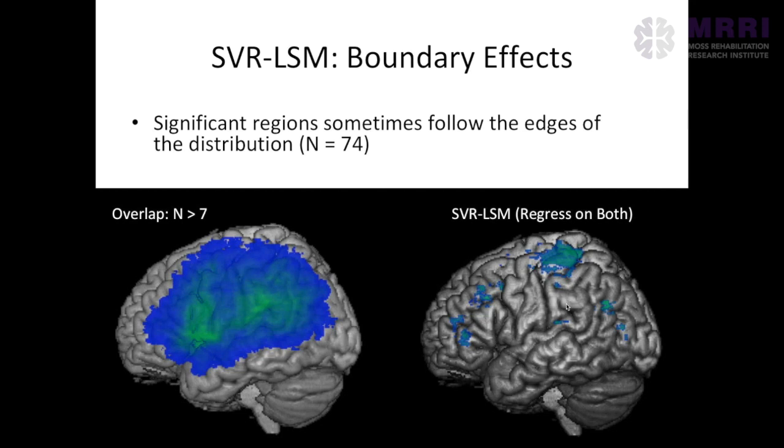So in this case, the map on the right is giving you the areas that have the least amount of coverage, or it's penalizing you in areas where you have the most amount of coverage. What we see here, and that's typical with a sample like this, is the insula, lateral to the IFG, and then posterior into the IPL. Right, looks very typical for a stroke distribution map. Yep.